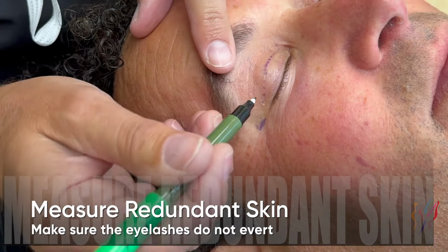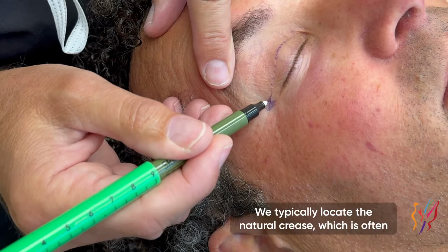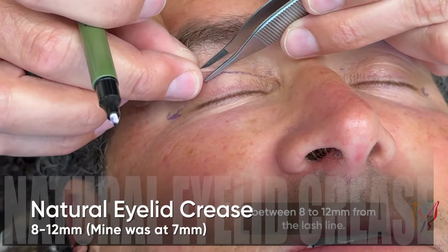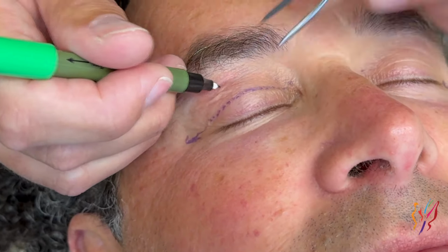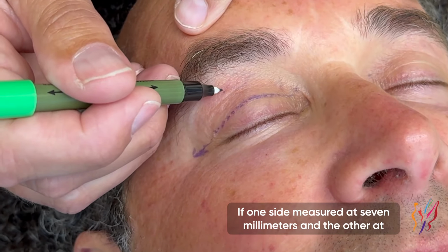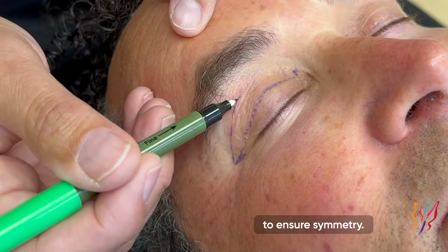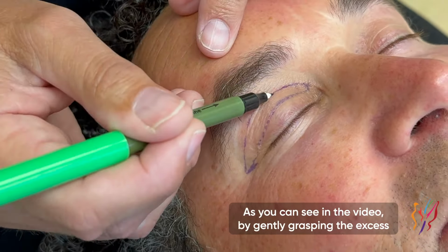Once we were in the operating suite, the first step was to carefully measure and mark the eyelids. We typically locate the natural crease, which is often between 8 to 12 millimeters from the lash line. In my case, my natural crease was at 7 millimeters. If one side measured at 7 millimeters and the other at 8 millimeters, we would average them to about 7.5 millimeters to ensure symmetry. Next, we mark the redundant tissue, as you can see in the video.